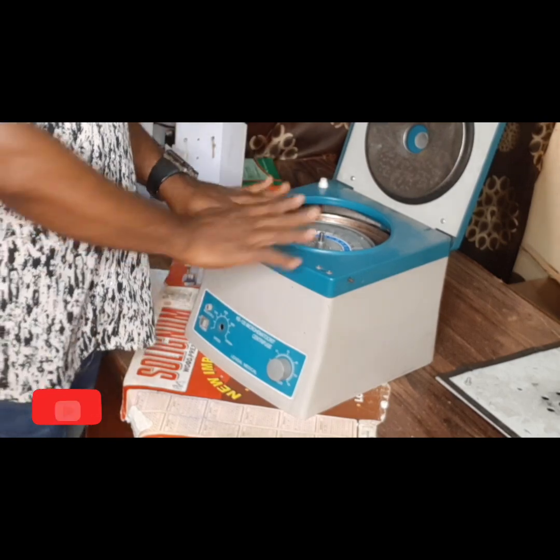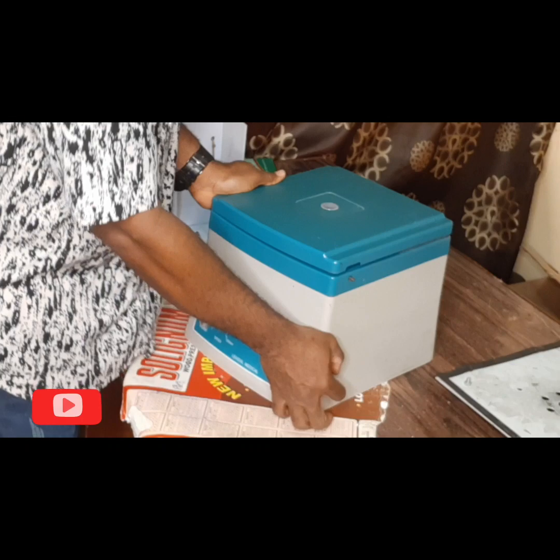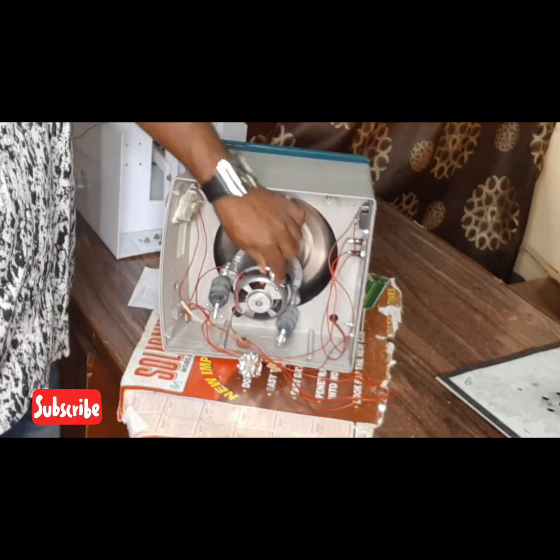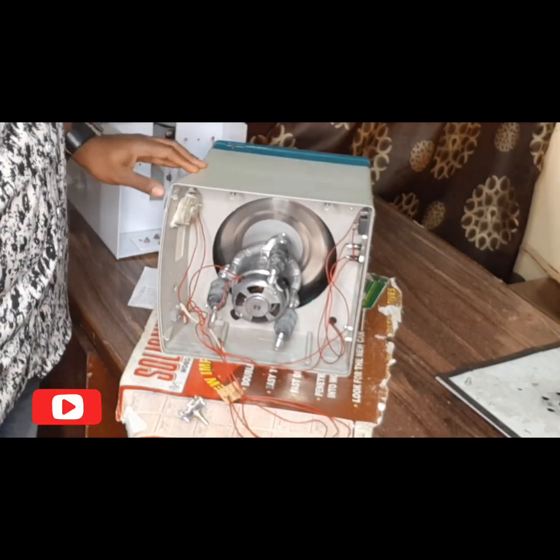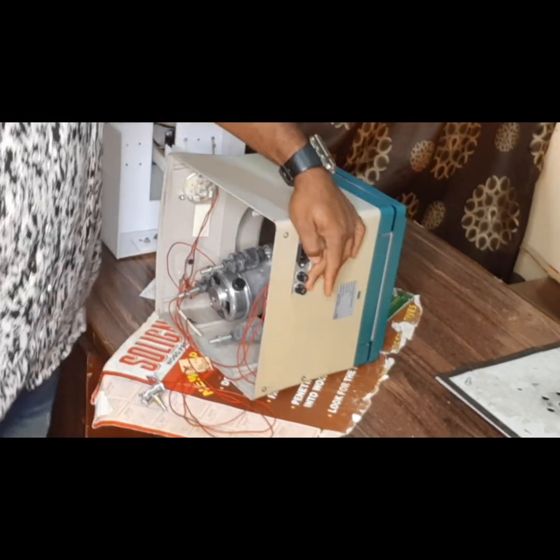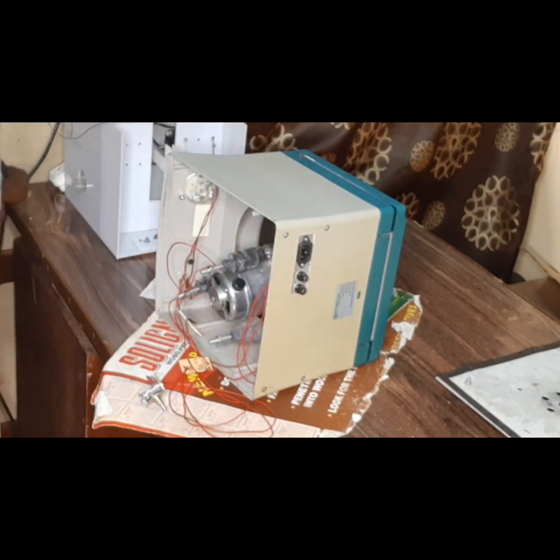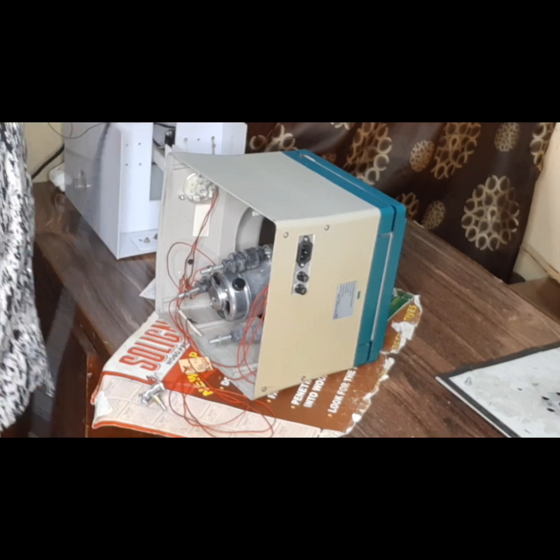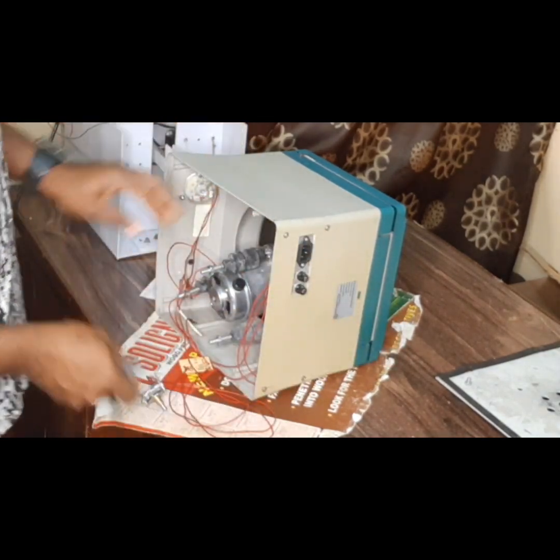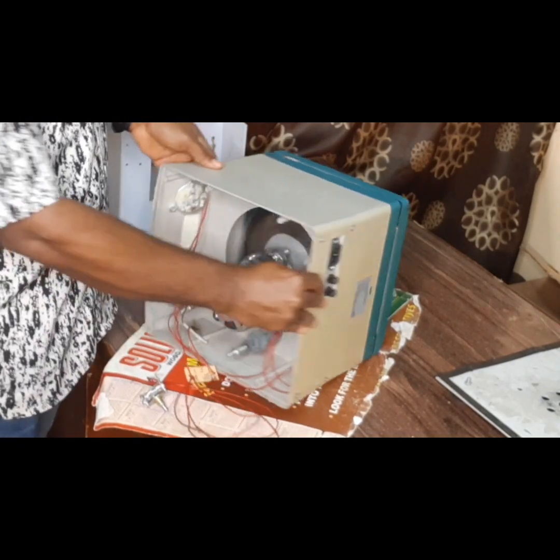So this is the machine. I've been able to disassemble this. Let me go straight to show you the internal wiring through the bottom. Here you see the entire wiring of the machine. So here is the fuse I mentioned earlier. Here is the cord where you plug in the supply cord. You can see this is where you plug it in. But for now, we don't need it on. So these are the two fuses.